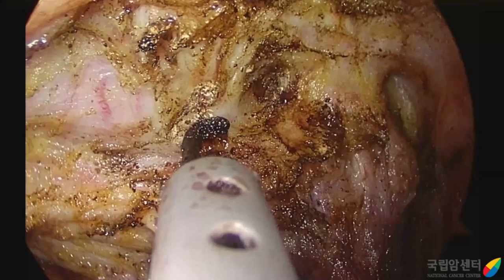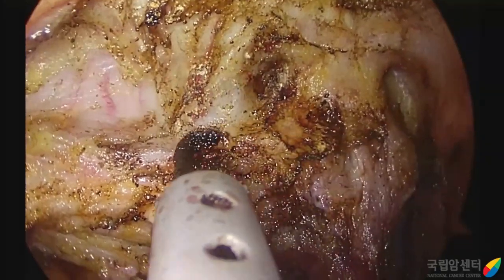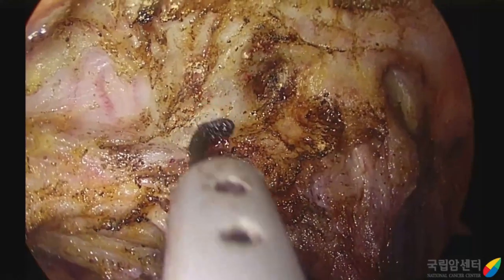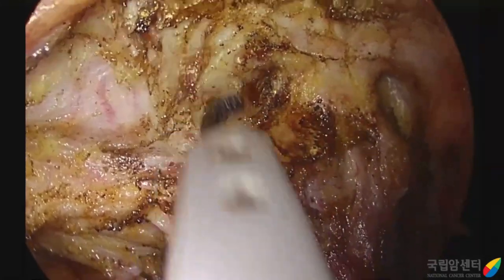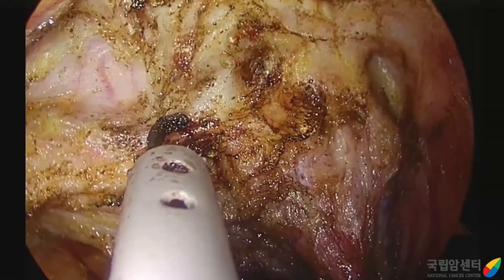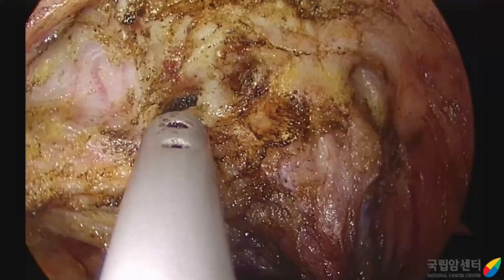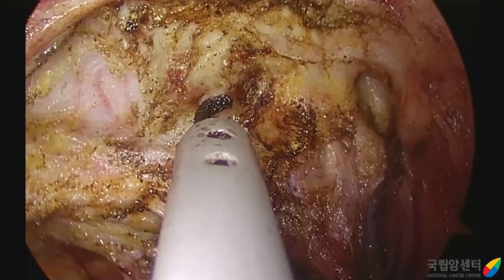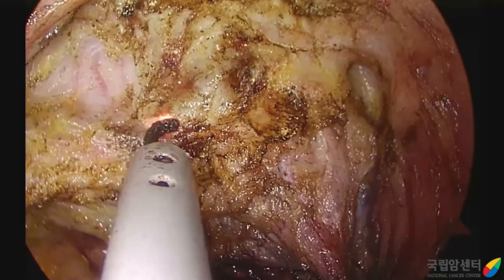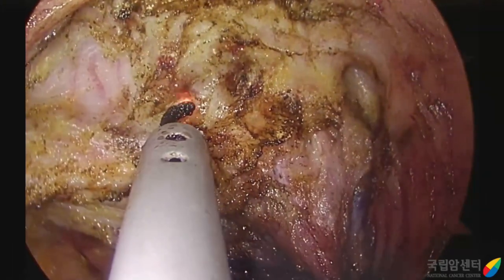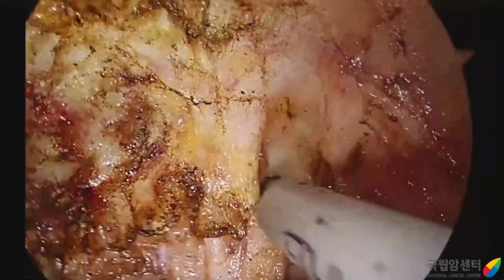This kind of venous bleeding can be obscured because of high CO2 pressure in the narrow pelvis. In this situation, a large amount of CO2 gas can flow into the vein, resulting in CO2 embolism.